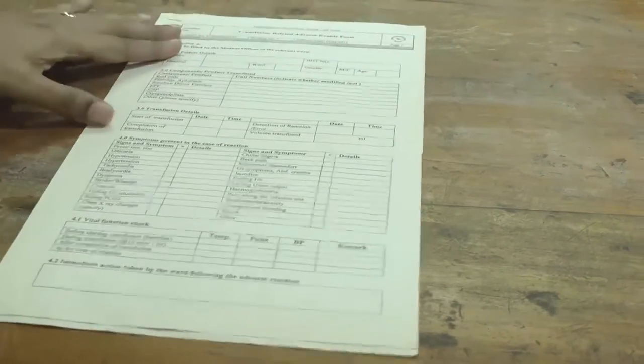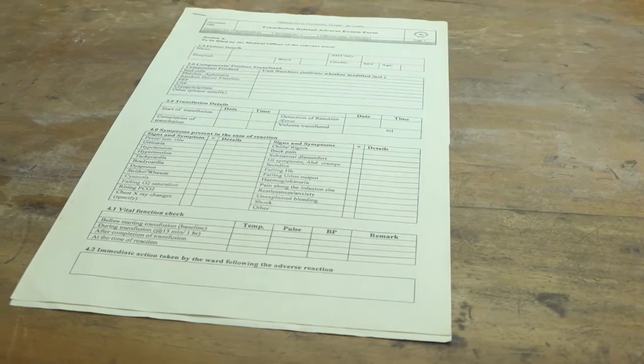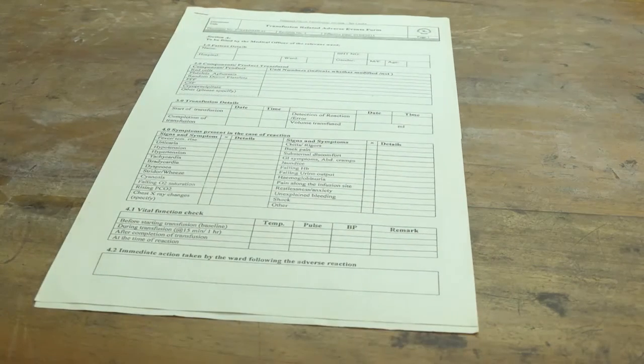If an adverse reaction occurs when you are giving blood or platelets or plasma, you have to fill in an adverse event form such as this and send it back to the blood bank with the blood pack which was responsible for the reaction, 2 ml of EDTA blood and 5 to 7 ml of plain blood. You have to make sure that you always report adverse events back by filling out this form.